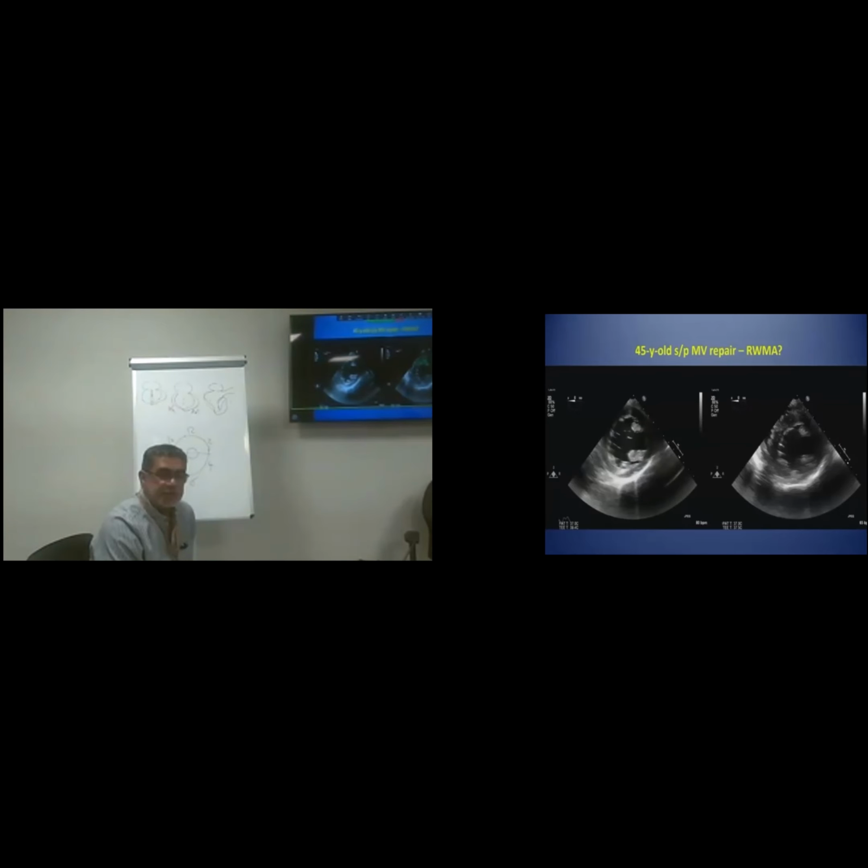This is Dr. Galal now. Area 2. Area 2. Inferolateral. Now we want to go on bypass again and repair what we did. Now see how the difference. Thank you.